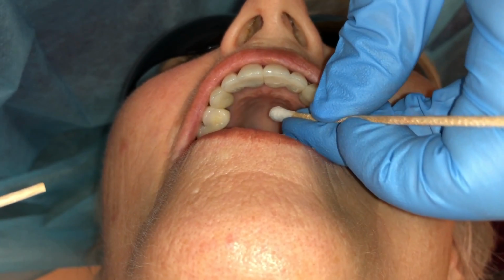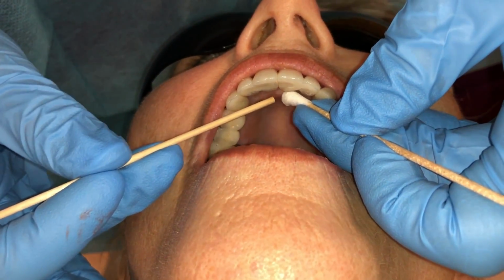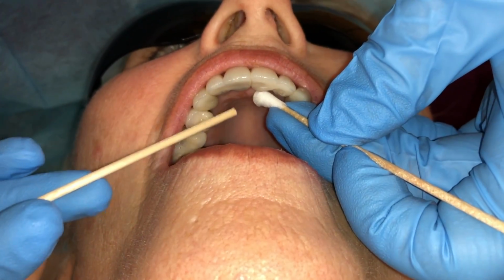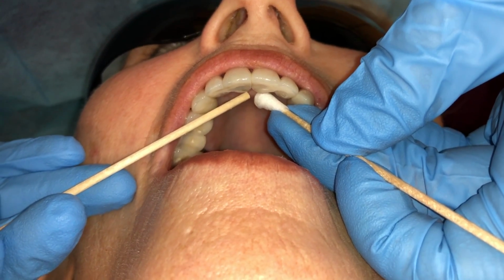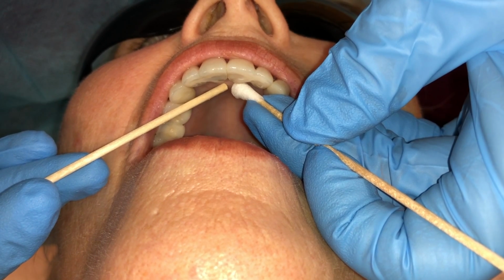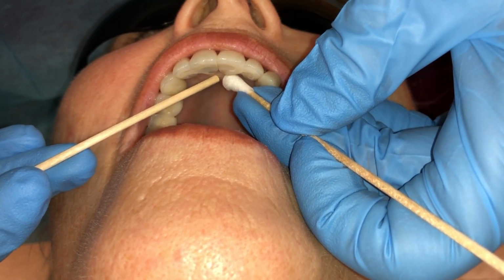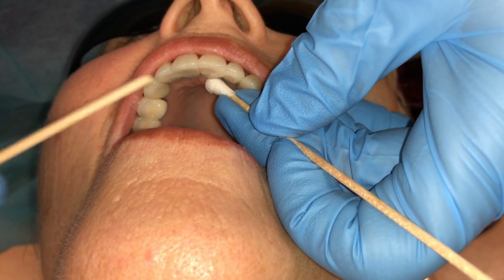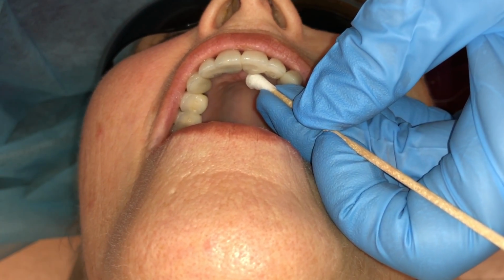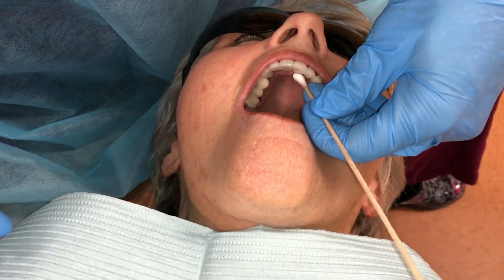If a clinician determines to use a two-step process for this technique, you could choose pressure anesthesia. Note in the video the clinician is holding the cotton tip applicator very close to the head and applying pressure from one side, still allowing access from the other side for needle penetration. Slow deposit is key for this injection, as all other palatal injections, due to the tightness of the tissue.